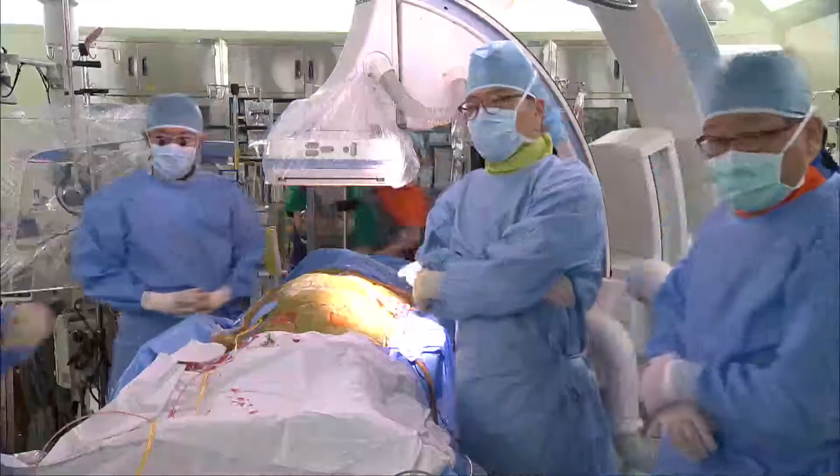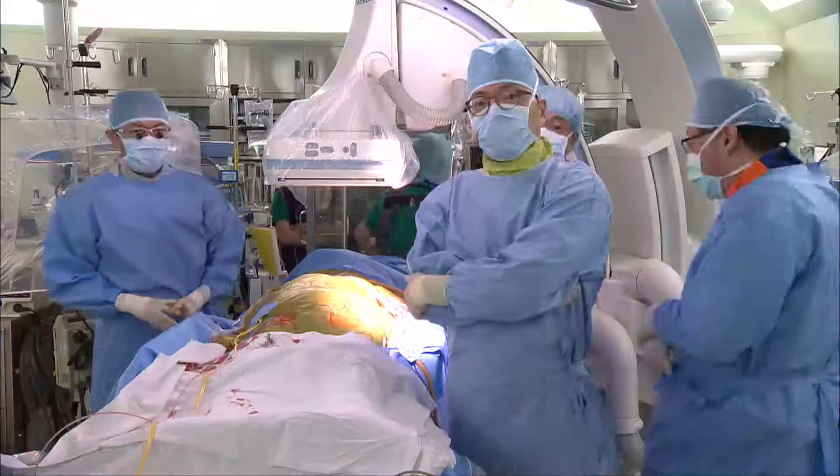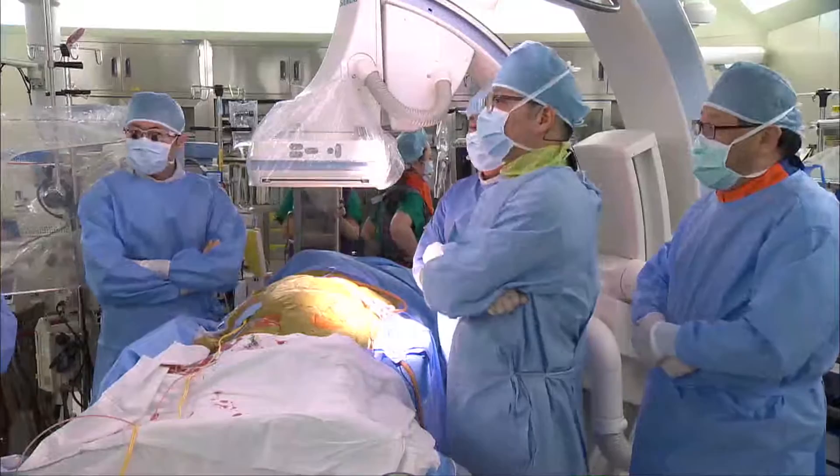Good morning, ladies and gentlemen. Let's start our first session of the live case from Aslan Medical Center. Jian, are you there? Yeah, I'm here. Can you hear? Good morning, I'm Dr. An from Seoul National University Hospital.